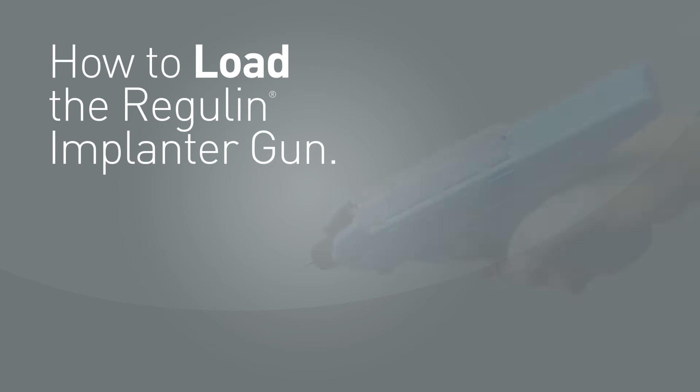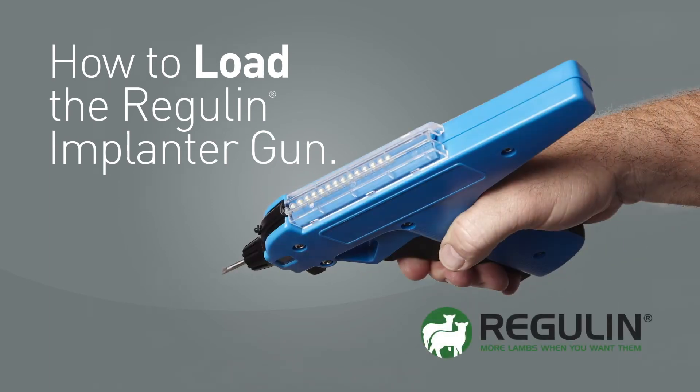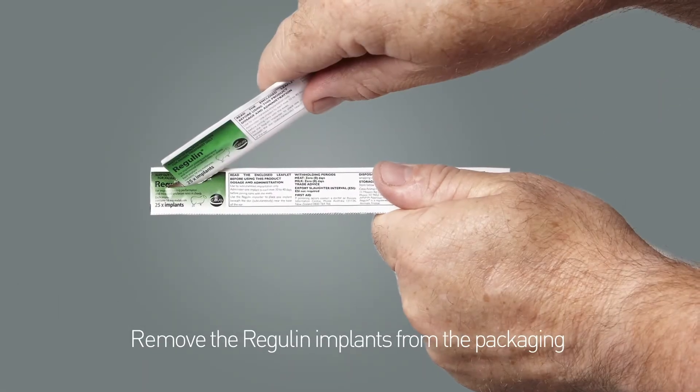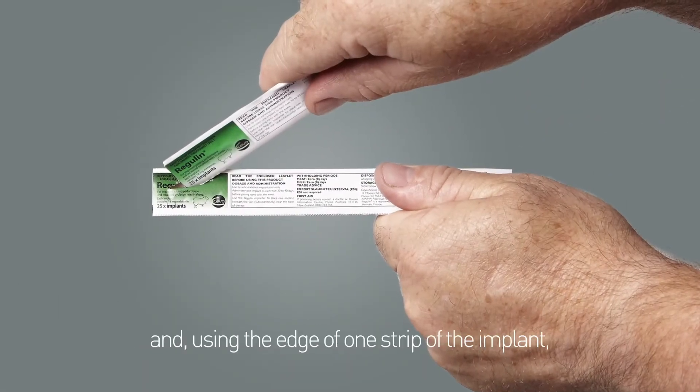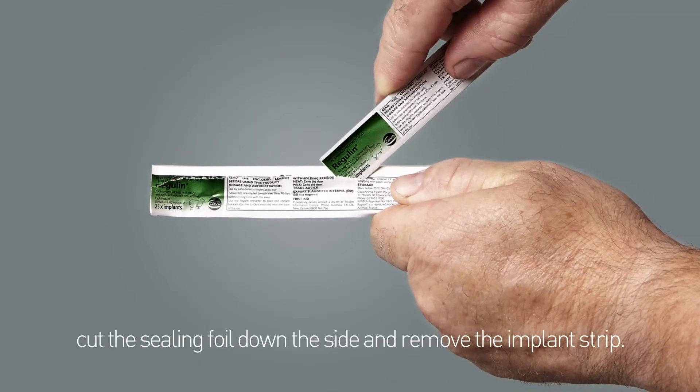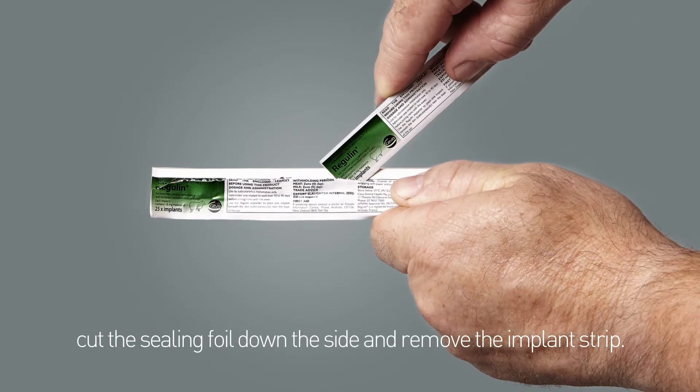Welcome to a short video on loading and unloading the Regulin Implanter. Remove the Regulin implants from the packaging and, using the edge of one strip of the implant, cut the sealing foil down the side and remove the implant strip from the packaging.